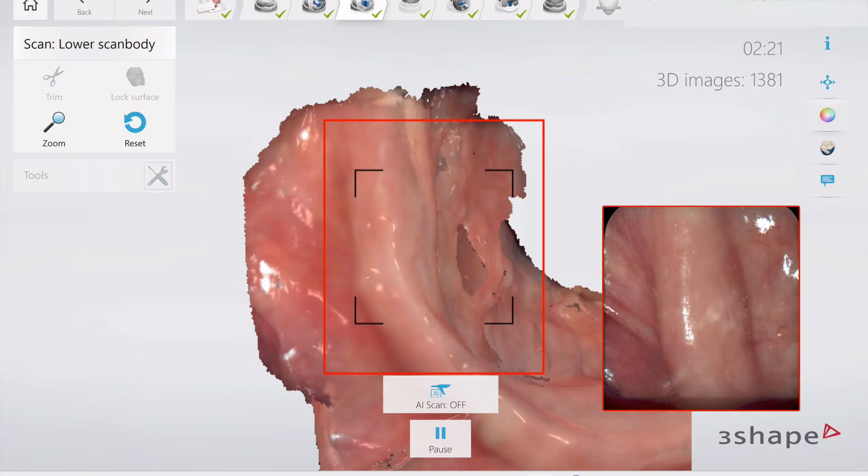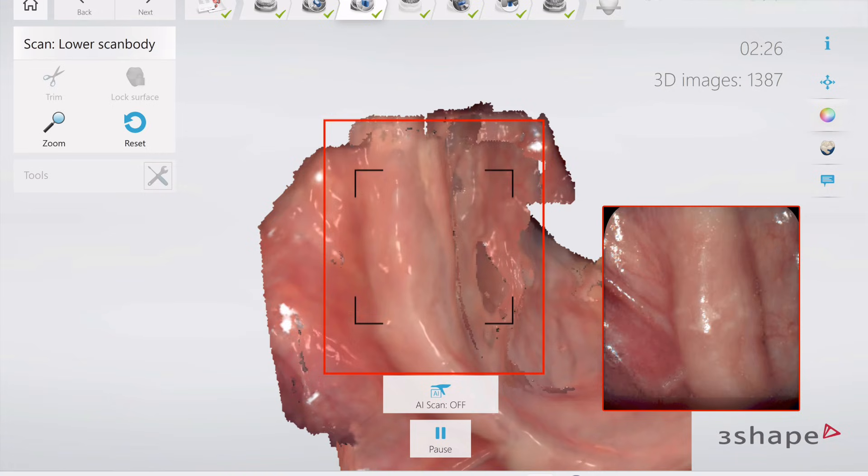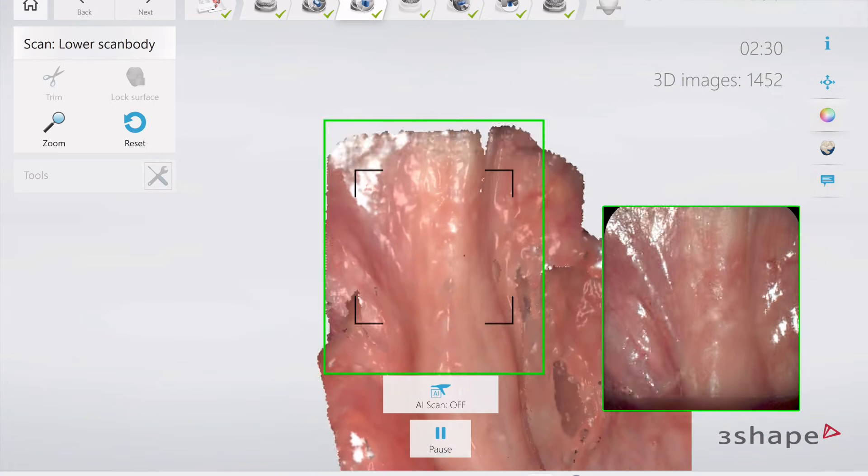So we're going to start right back there. Pick that right back up. There we have it — got a little bit of pickup, and now we can go to town.